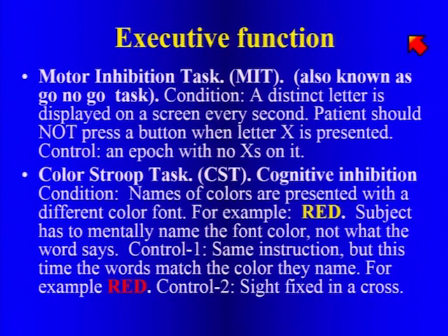A couple other tasks we do are motor inhibition and color Stroop tasks. We find these useful in patients with ADHD. In the motor inhibition task, a letter is displayed on a screen every second, and they shouldn't press the button when they see the letter X.